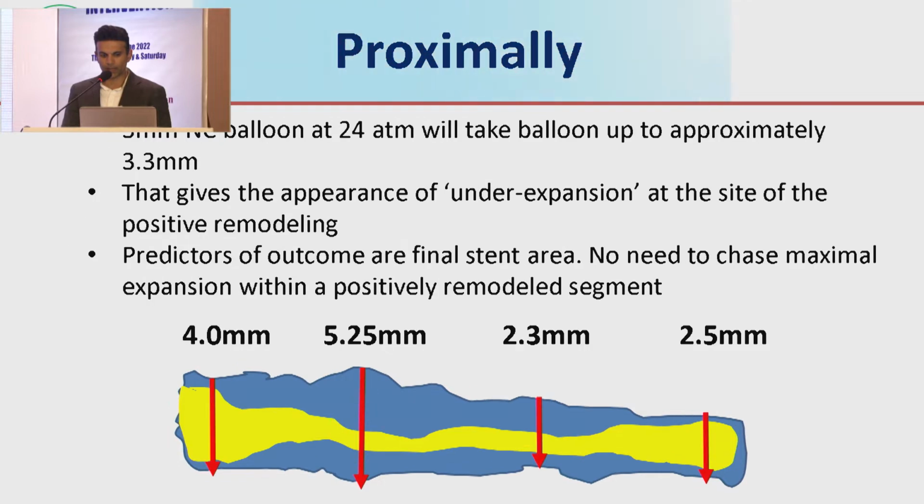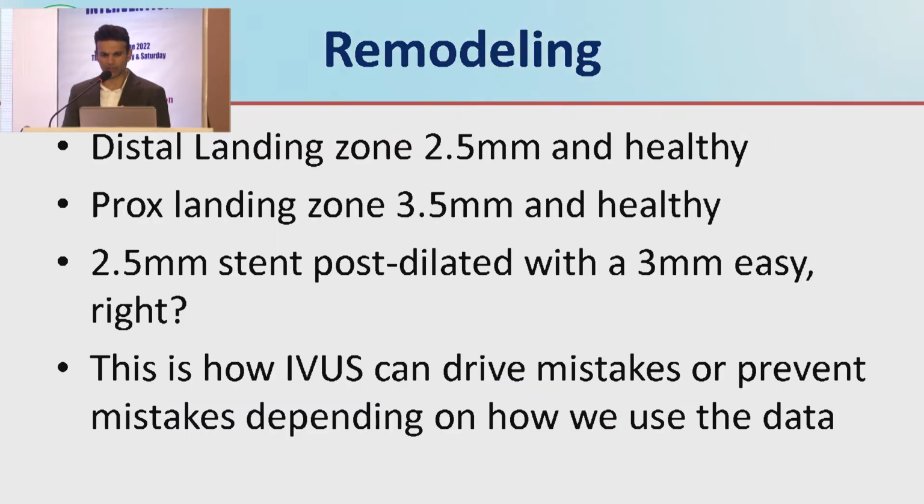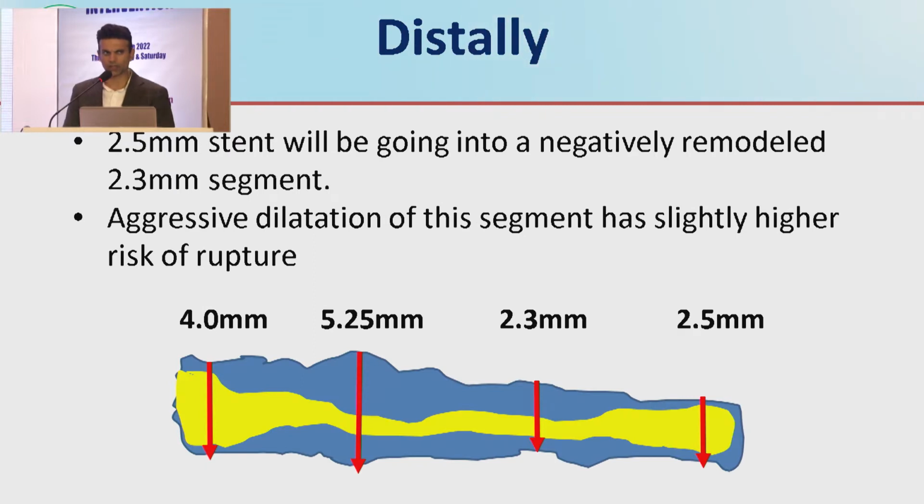And just very quickly, I don't know why it skipped this one, but I'm going to give you two quick thoughts about this last one. Sometimes we get negative remodeling in the middle of the vessel, right? We've all seen that, right? And this is where the IVUS is absolutely critical. This is when perforations happen and where the intravascular imaging really tells you. Whether it's IVUS or OCT, doesn't matter.